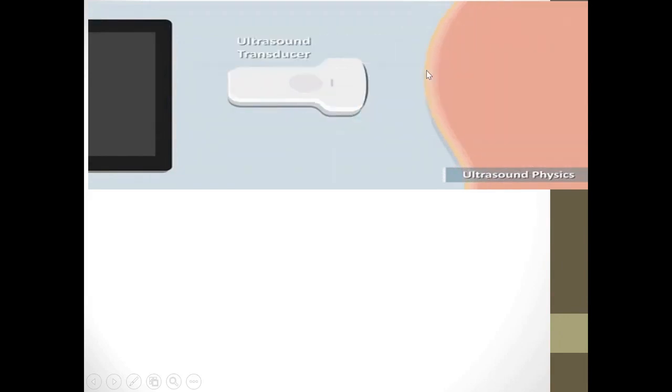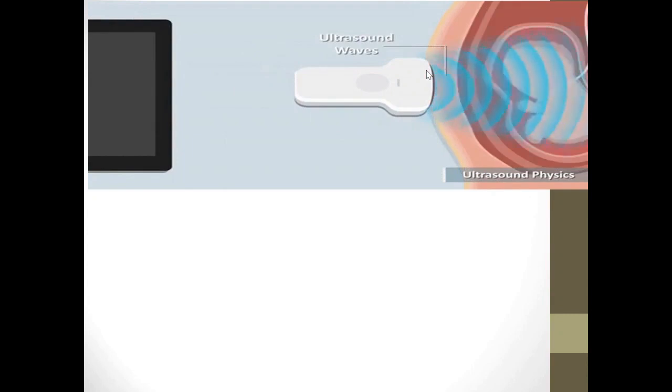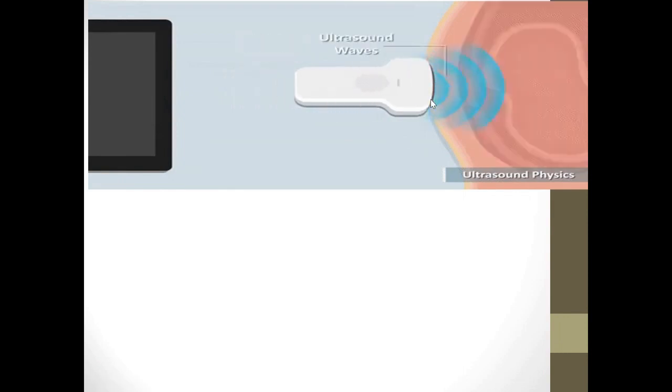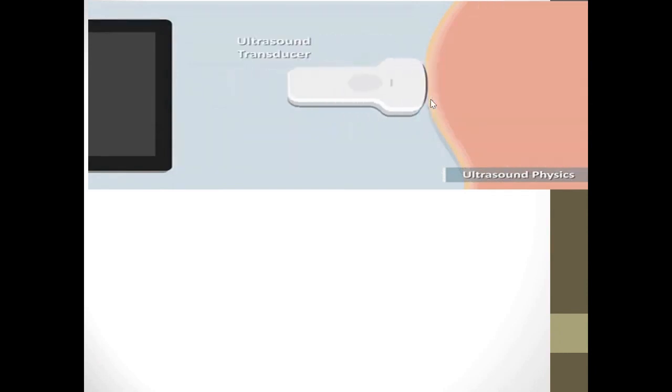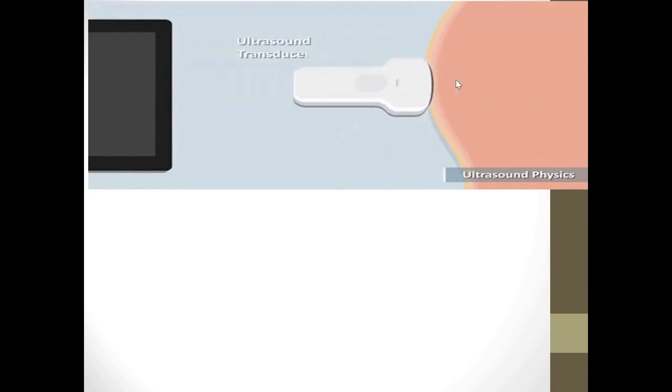So now I have the source of ultrasound, number 1. The production process for the ultrasound pulse is taking place. This ultrasound pulse has specific characteristics, including a certain frequency and wavelength. The pulse is produced at a specific frequency, meaning, for example, I produce a certain number of pulses per second, or what is referred to as pulse repetition frequency.